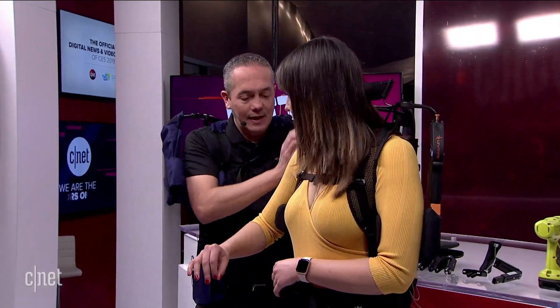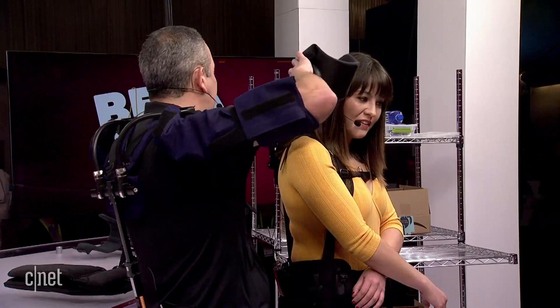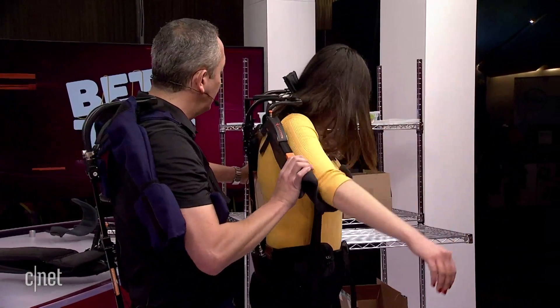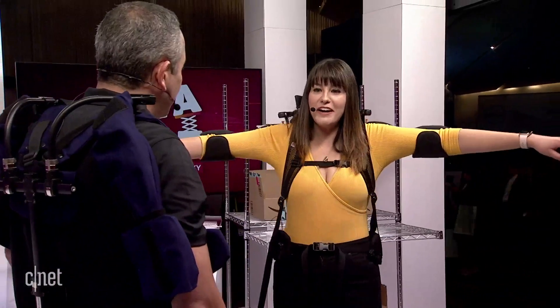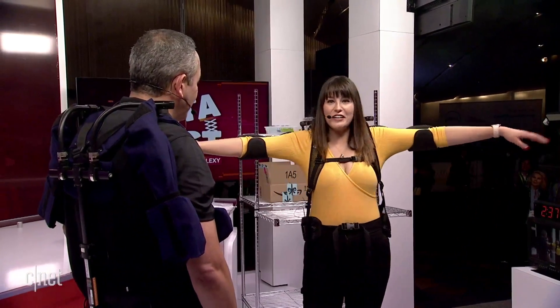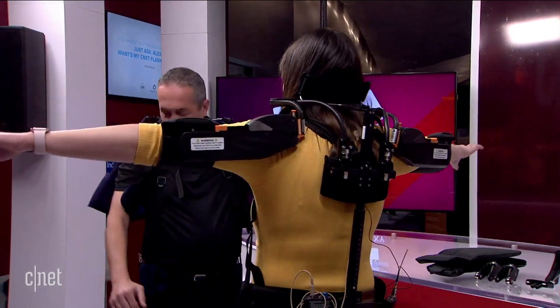Right now it is deactivated. If you could get your arms out of the device, I'll activate both sides and you can swing your arms back in. Now it's active and it's helping you. My arms are just being held up automatically — I don't feel like I'm doing anything. And when your arms are lowered, the force goes away. So I'm moving around normally, and then my arms are up and I can stand here all day.